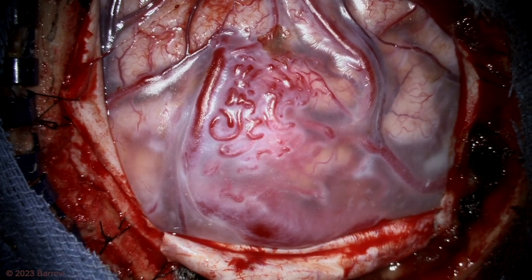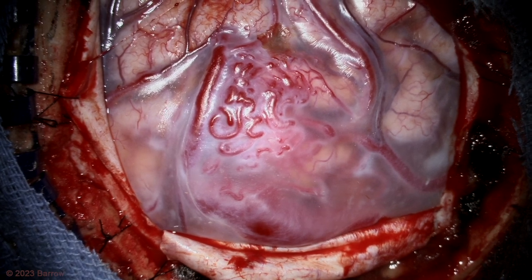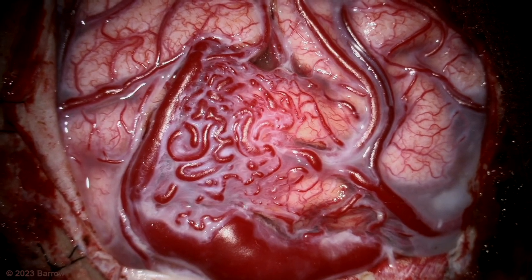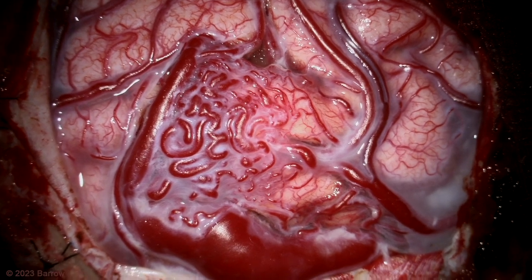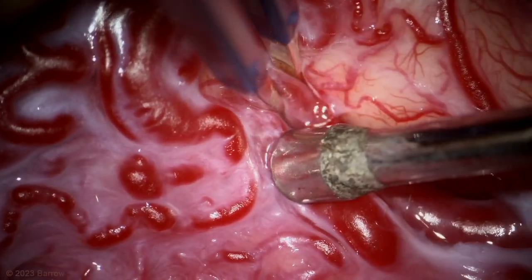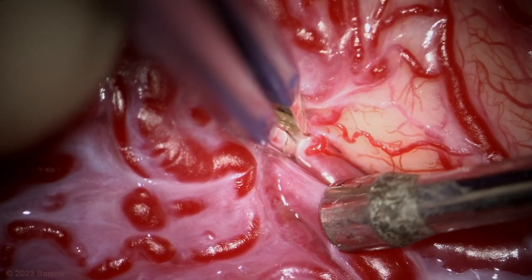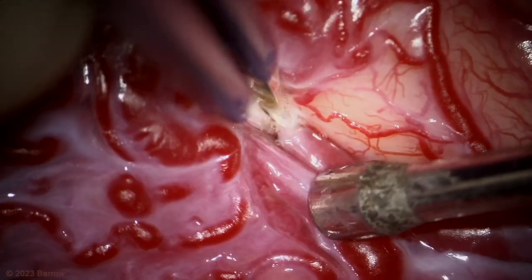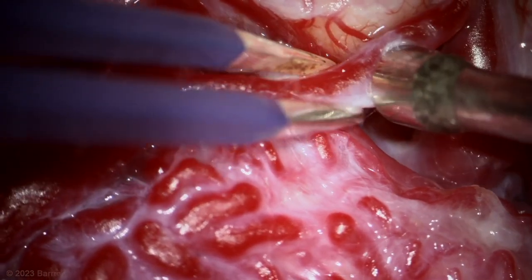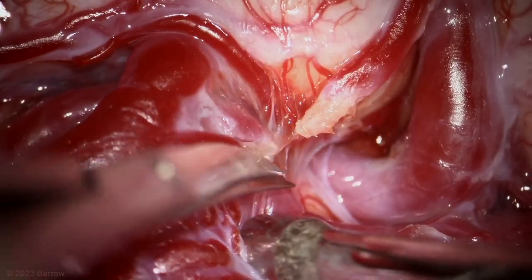Here is an overview upon opening the dura. The superior sagittal sinus is at the bottom of the field and the ear is at the top of the field with the nose to the right. The early steps of the dissection are focused on identifying these large middle cerebral feeding arteries coming into the lateral border. Once these are seen, they are cauterized to reduce the flow through the nidus.